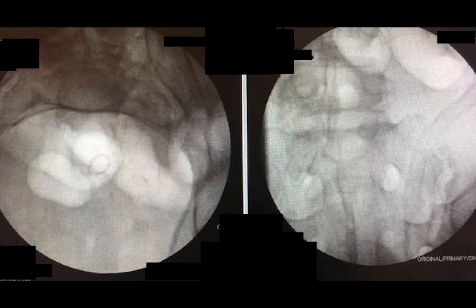So I took the patient to the OR, and predictably, the SI joint opened up on stress testing, and I thought it would be worthwhile to put a sacroiliac screw in the back. You see the inlet view over here, and some people like to measure the degrees that they think the inlet view will be based on CT scans and angles. I do that just to give myself a sense of approximately where it will be, so I can tell the tech approximately where to angle the C-arm. But for the most part, I just rely on visualization.